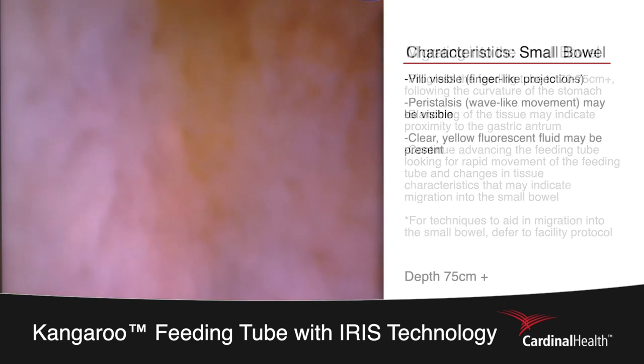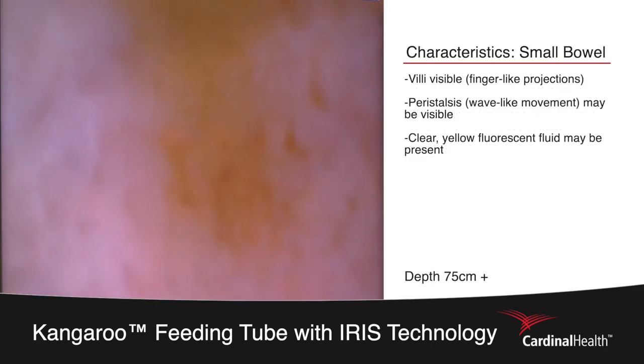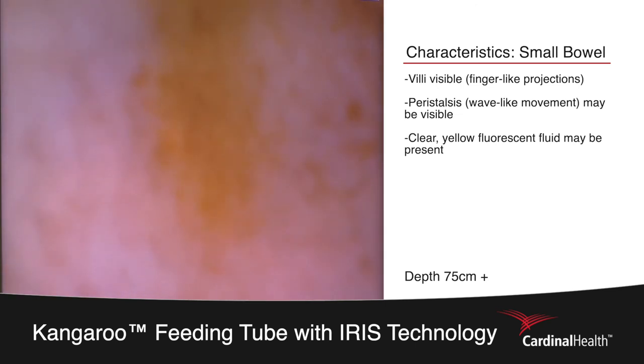We now see a change in the tissue. The tissue of the small bowel is covered with a finger-like projection called villi, that will move around the feeding tube in a wave-like fashion.